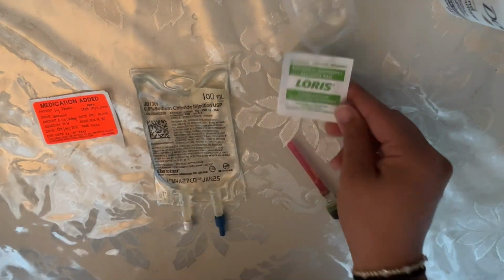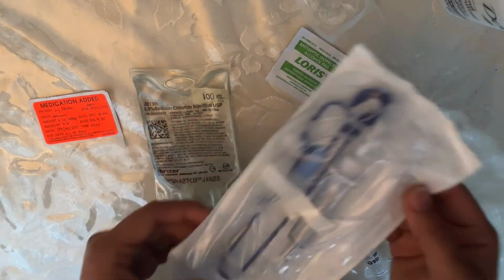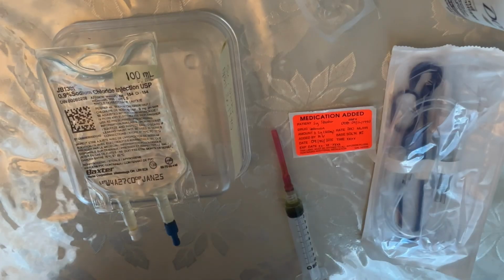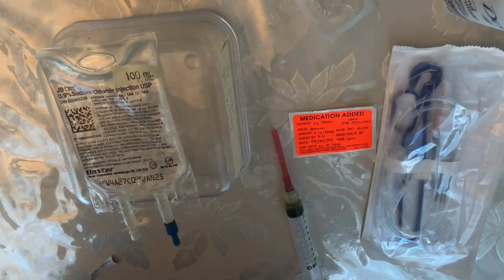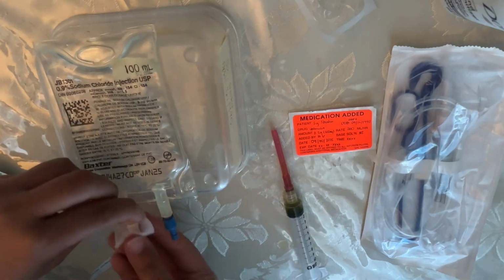You also need an alcohol swab and the secondary IV line that we're going to piggyback to the primary line. Now, we're going to swab the medication port for 15 seconds, and we're ready to insert the medication.